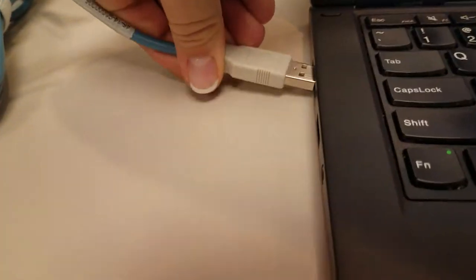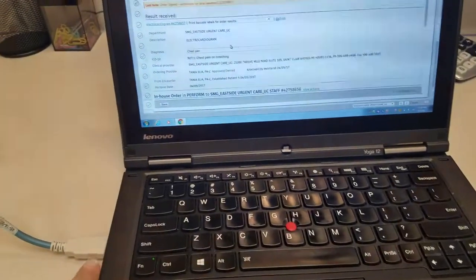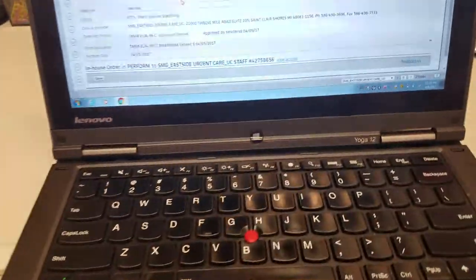You're going to bring the EKG machine in, hook up the patient. You're also going to hook it up to the USB port here.